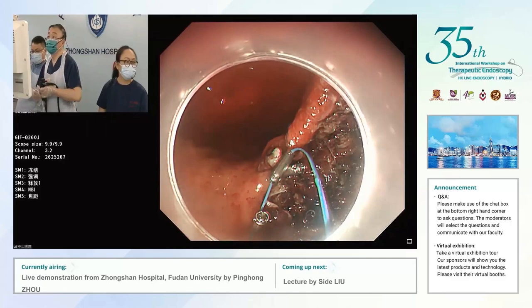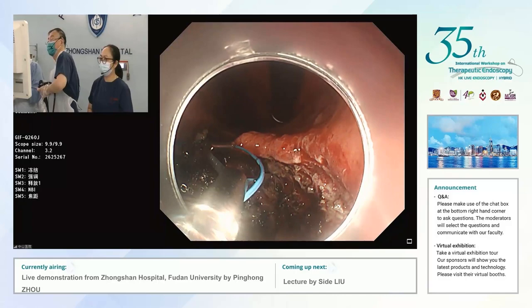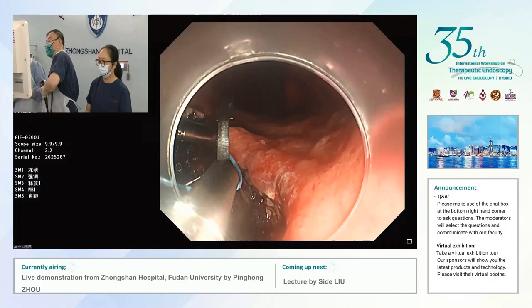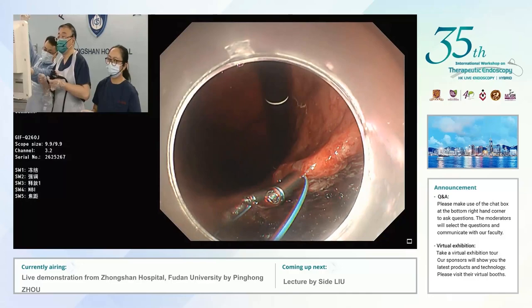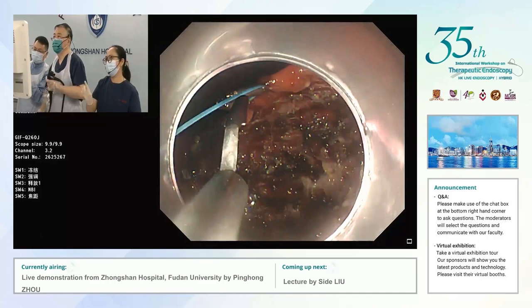You close the loop and then assess how much remains. You may not even need another loop if the two sides are already approximated. Any tips on how to close this? I think you're doing it very nicely, Professor Zhao. The nurse is also very important — they will adjust the clips with the loop so it fits well.